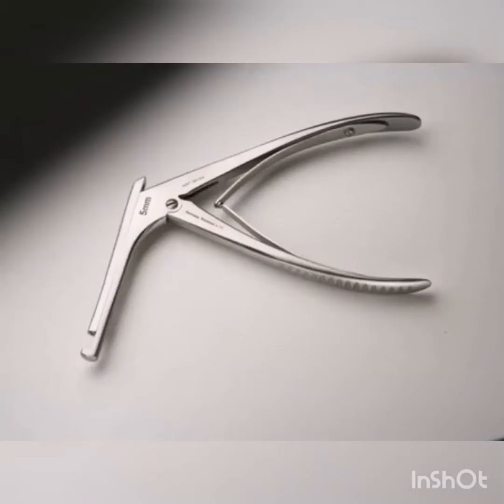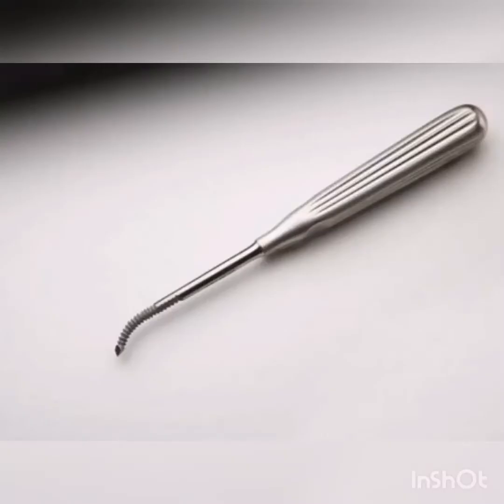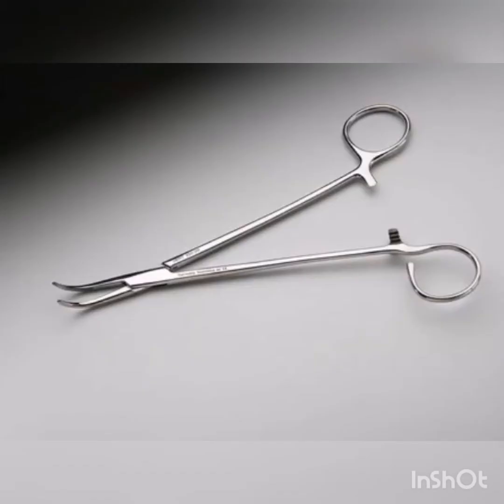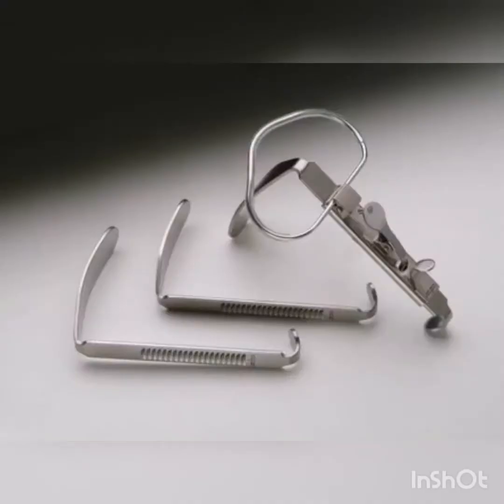Kerrison Rongeur. Weiner Antrum Rasp. Barnhill Adenoid Curettes. Schnidt Tonsil Forceps. McIvor Mouth Gag.